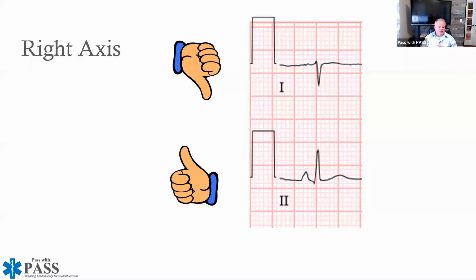And the answer to that is, if my right ventricle is requiring all of the workload, basically meaning it gets the most amount of electrical stimulus, I'm probably dealing with something that has affected the lungs. If the lungs are the problem, now my right ventricle has to work harder. So this could be a pulmonary embolus. It could end up being that the patient has pulmonary edema. It could be right ventricular infarction. So there's all kinds of different things that I could start to think about as to why my right ventricle is under a higher pressure to function correctly.